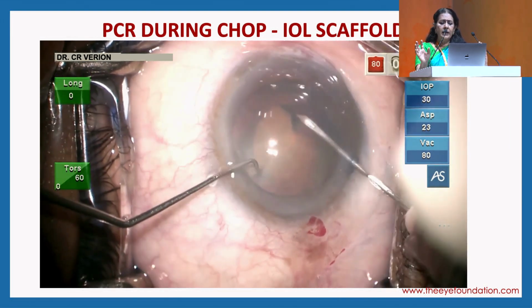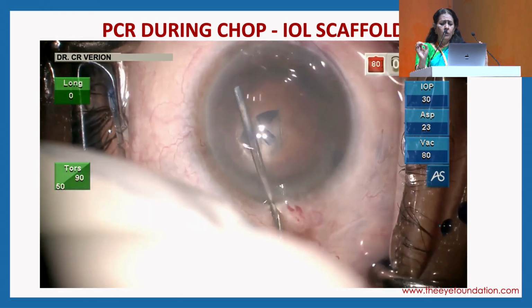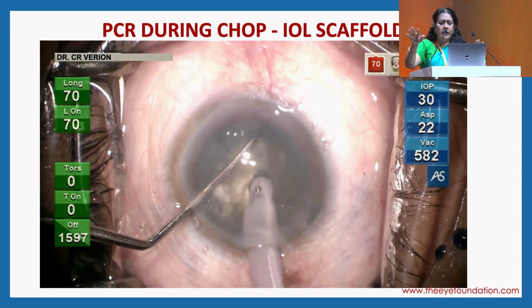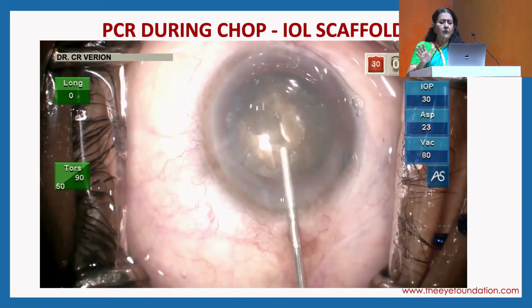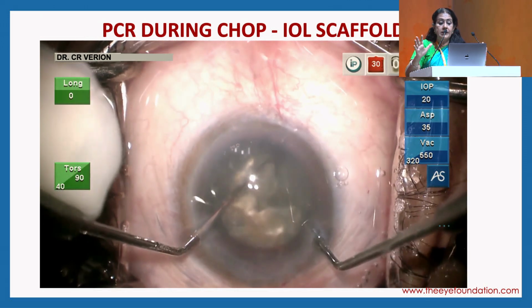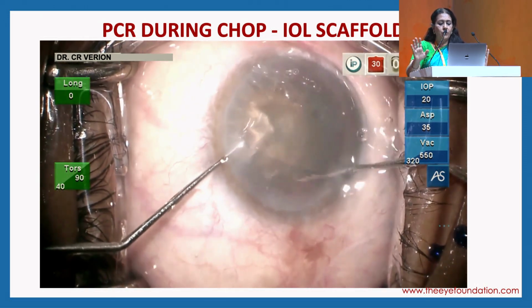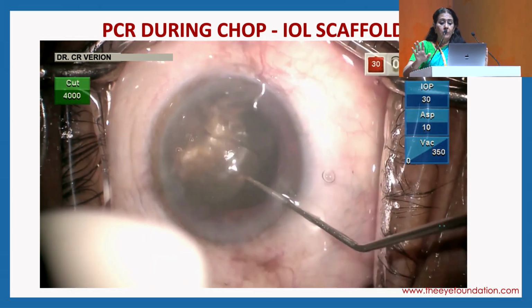Now this was another case where everything looked apparent at the slit lamp, and it was a dense cataract, and I've created a large enough rhexis, not too large. I follow all the dictums of the rule, a gentle hydro and decompression, and ensuring I rotate it so there's no stress on the zonules. But you know, I'm somehow not comfortable. First of all, my trenches were not deep enough, and I could do a sub-chop, but I feel that the lens is tilting. I'm just wondering, and then I decide, no, this is absolutely, the PC is open somewhere, I've gone wrong. So now I'm not able to visualize much.